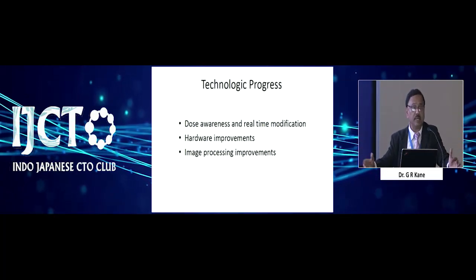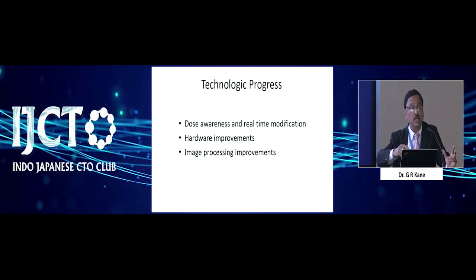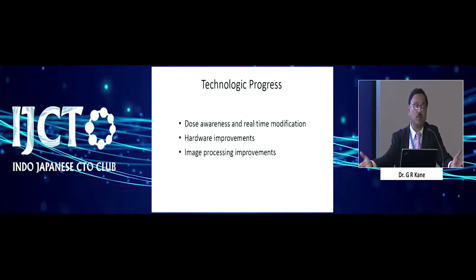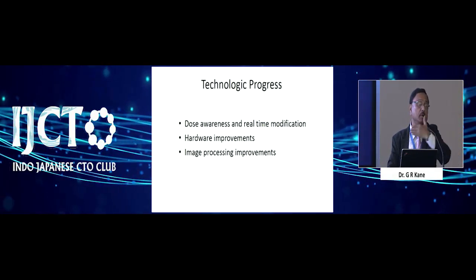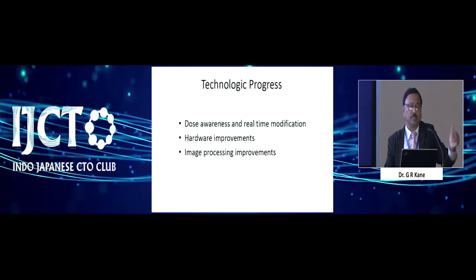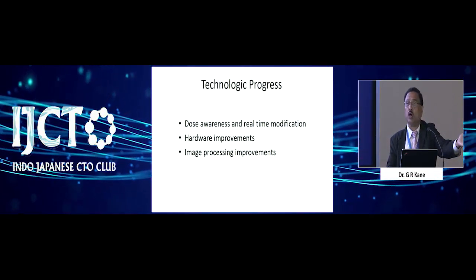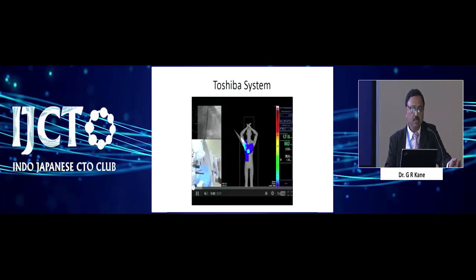There are hardware improvements in the cath lab machines themselves, but very few people may have access to the technologically high-end labs. We all work in different labs, and one has to know what the situation is. It's not just reading this and thinking, okay, these things are there. They may not be present in some town where you're working, and they may have bought a lab which does not have proper shields, doesn't have this, doesn't have that. So it is very important.